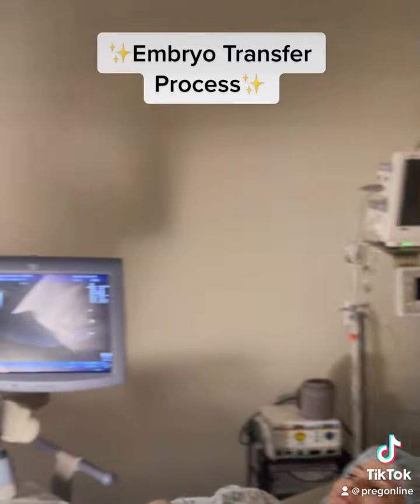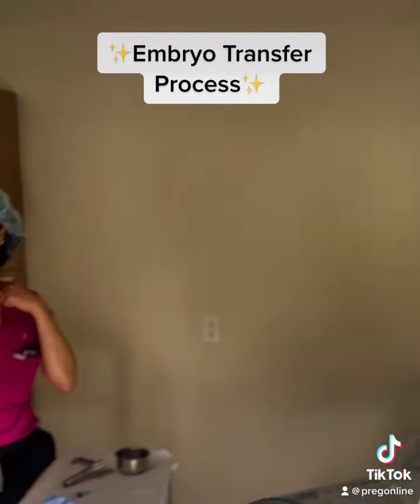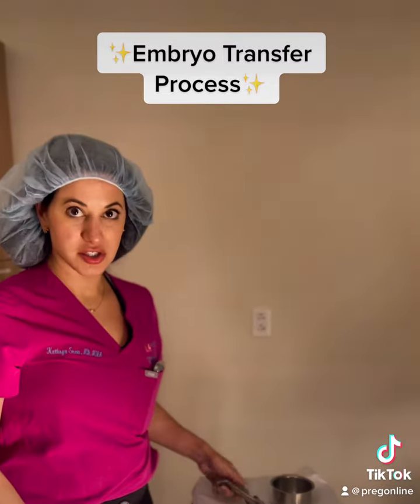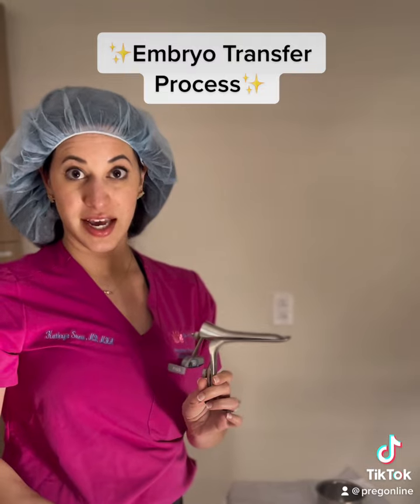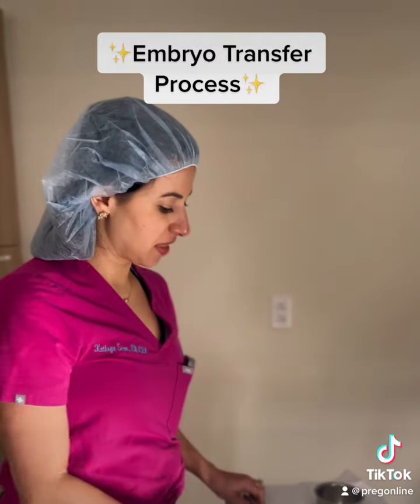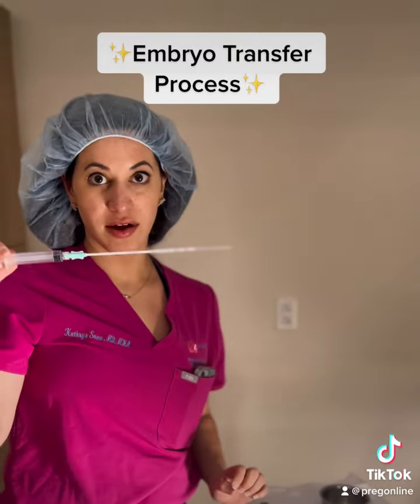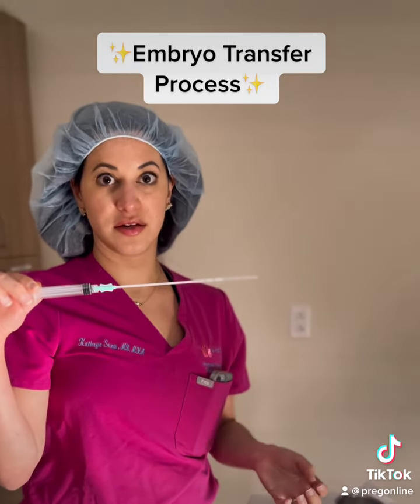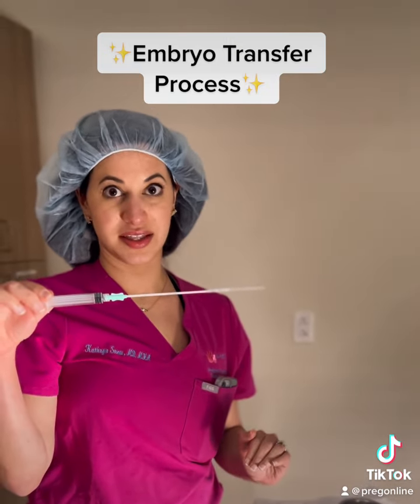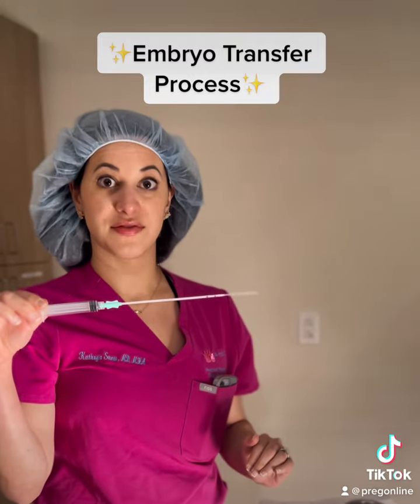Over here, we have the tools that we use for an embryo transfer. First, we use a speculum so that we can see the inside of the vagina and find the cervix. Next, we use what we call a flushing catheter, and this would flush the cervix of any mucus so that there's no resistance or issues at the time of the actual transfer catheter placement.